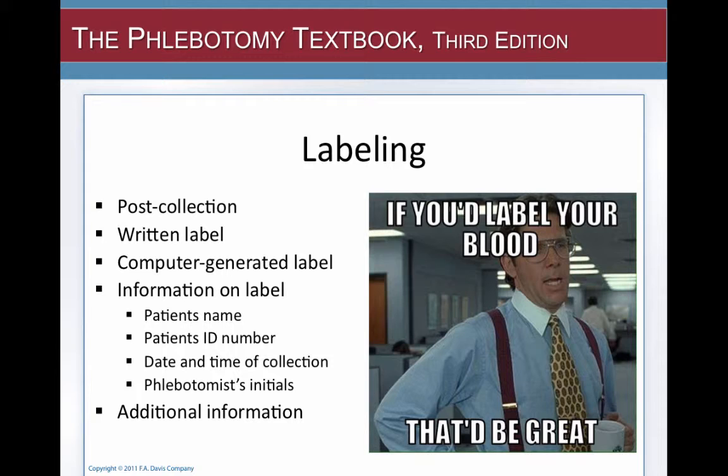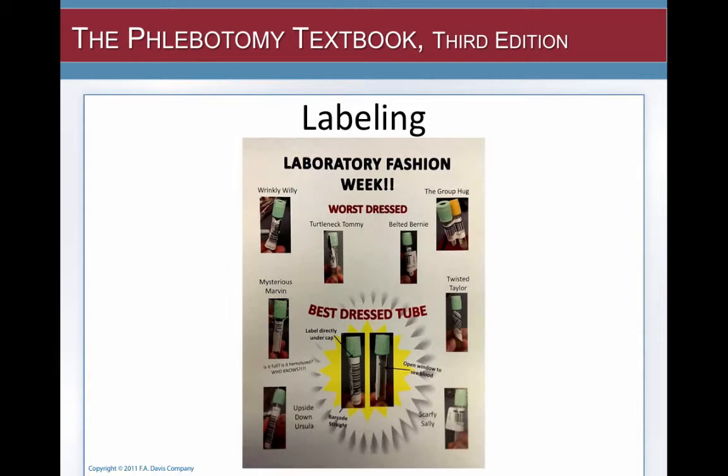I cannot tell you how many times blood and other specimens have come down to the lab unlabeled, and that causes a disservice to the patients because then they have to be restuck. There is a way that us people in the laboratory like our tubes to be labeled. You will see them labeled in all of these worst dressed ways.